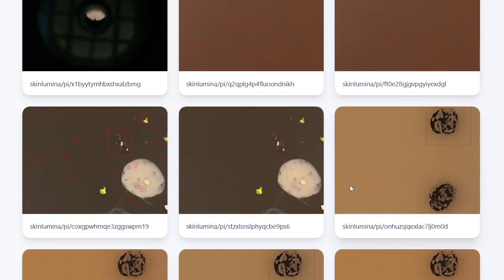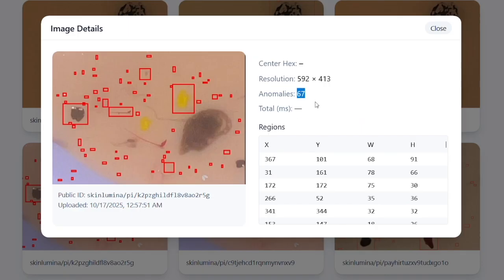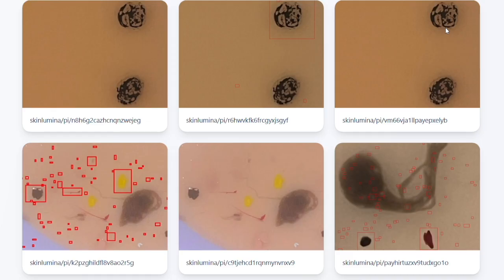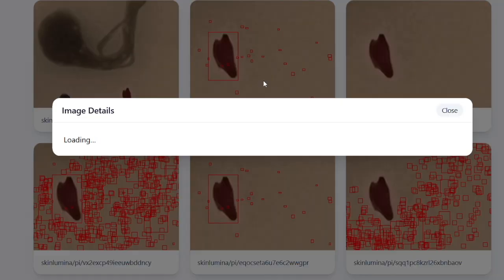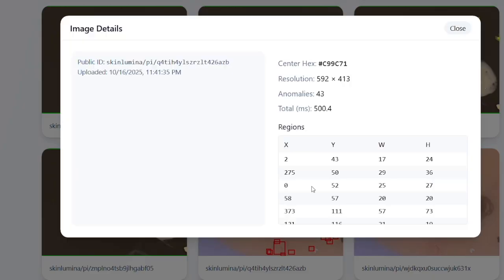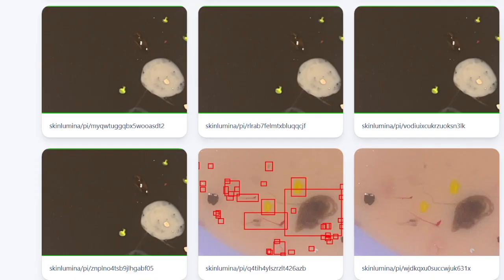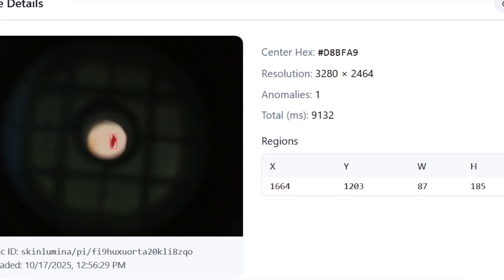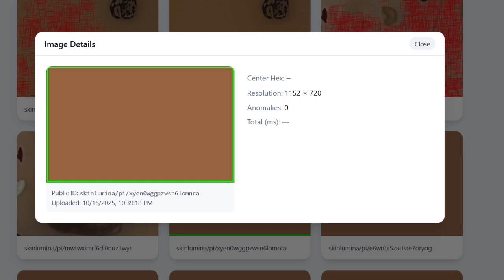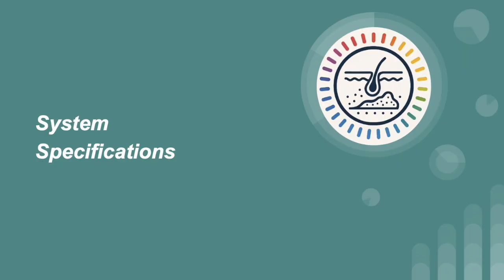On the image analysis side, we look for regions that stand out from their surroundings. We convert the image to a perceptual color space and for each pixel, measure how different it is from a locally smooth background. We use delta E as a color distance score. If that score is high, those pixels get grouped into a candidate region. We then clean the shapes and keep only solid, well-formed regions. If anything survives this analysis, it gets a red box. And if nothing meaningful is found, we draw a green border around the image to make it clear that there were no findings. Now let's move on to system specifications.